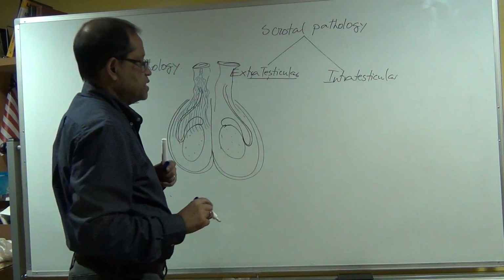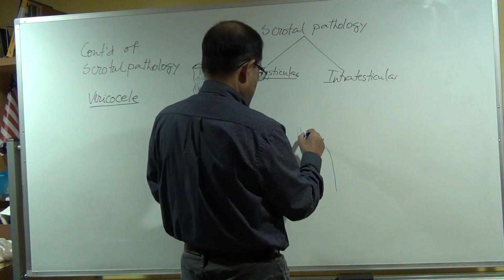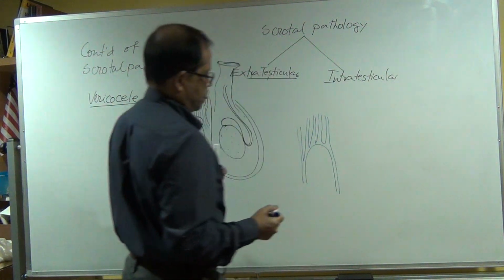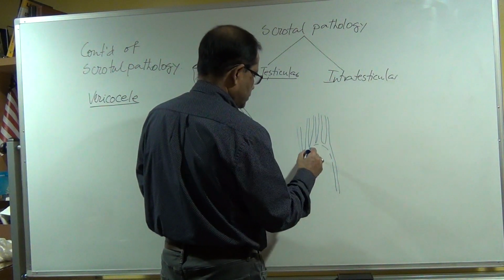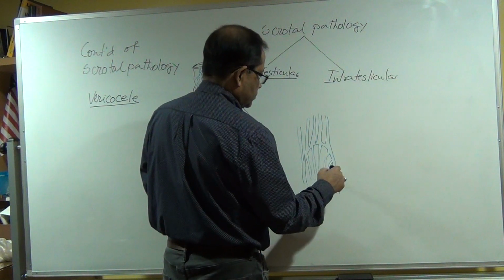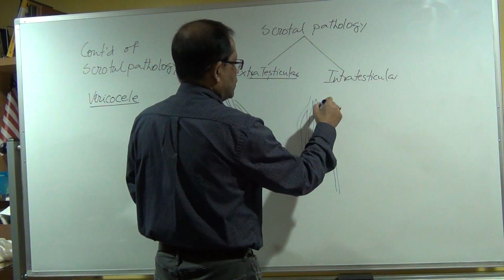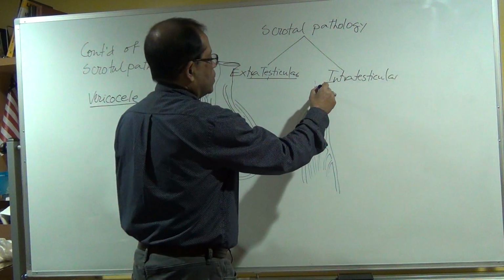So this pampiniform plexus, just now understand, I'm just giving you a little more. Look here.